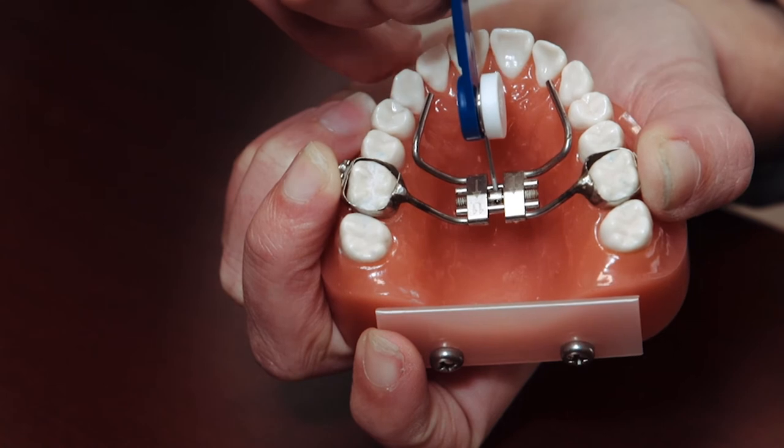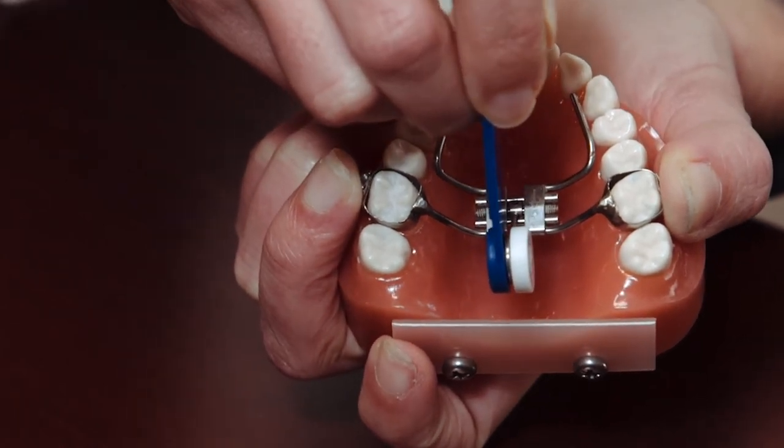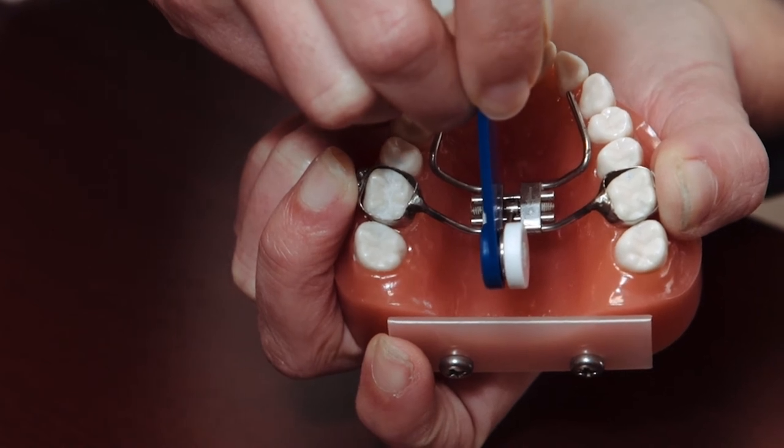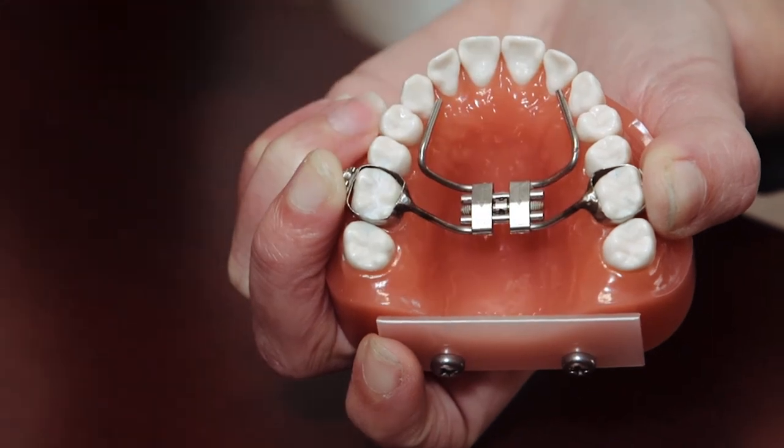Then take the key and direct it towards the back of the patient's mouth. That is one turn and you'll see the hole reappear on the other side. Then just lift the key back out straight out, and then you've made a complete turn.